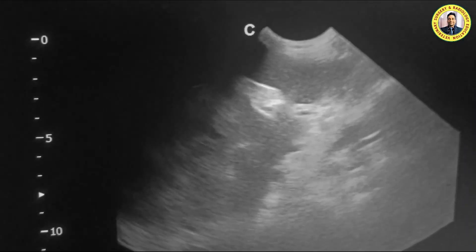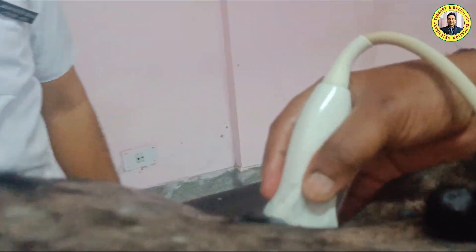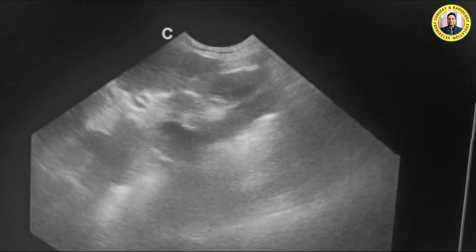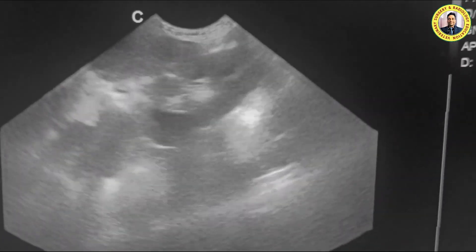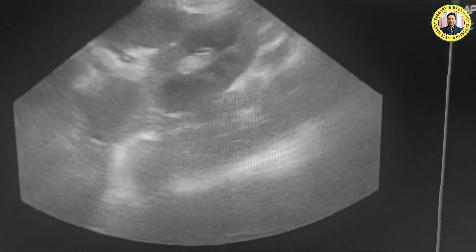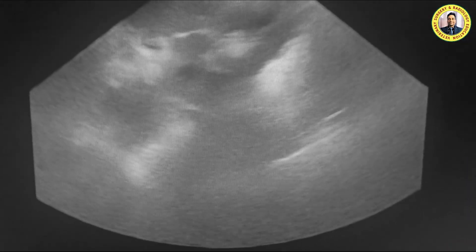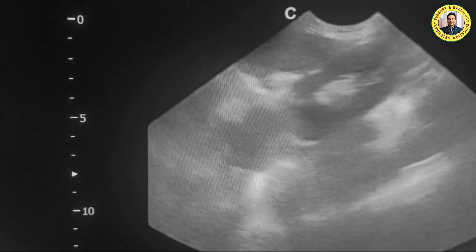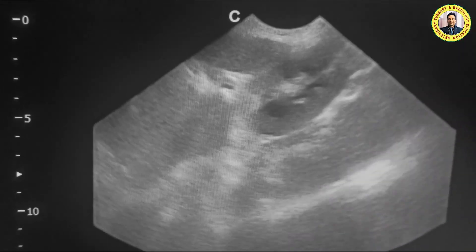This is the microconvex transducer, that is why it is very difficult to see things clearly. This is the left kidney, and you can see the spleen just cranial to the left kidney. Both kidneys appear to be normal in size.